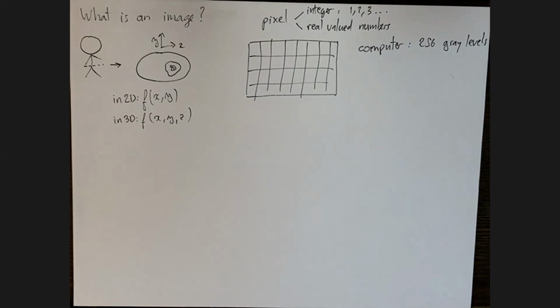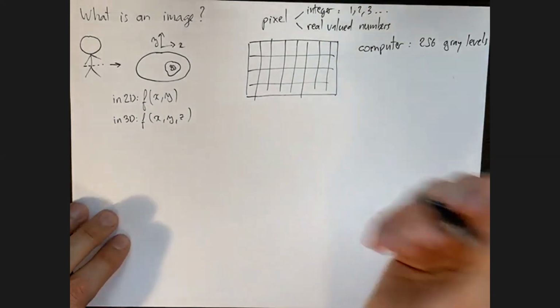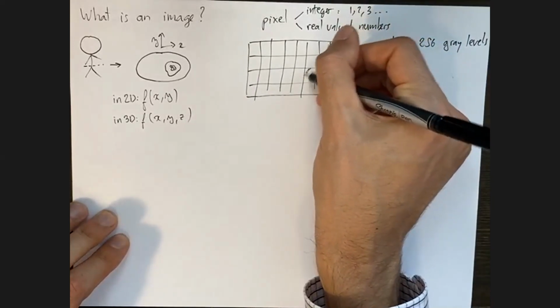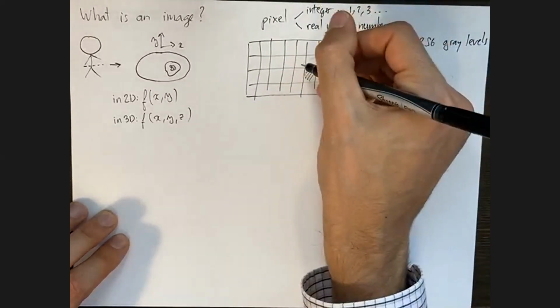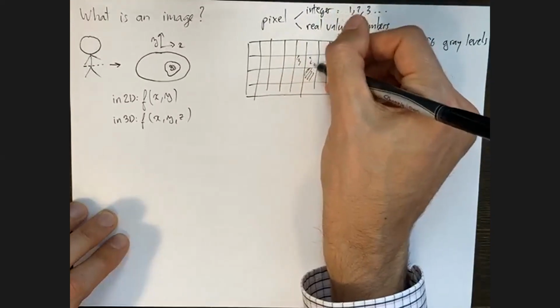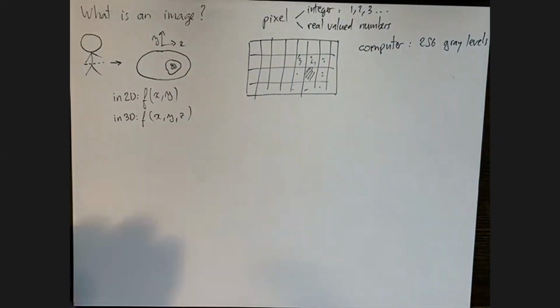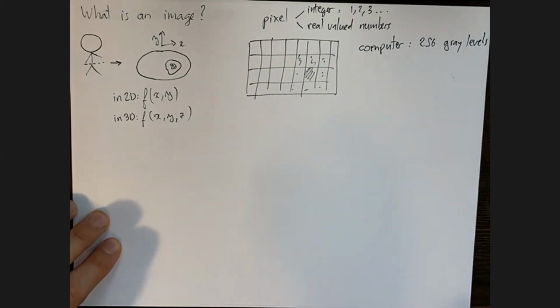We have the image that's represented as an array of numbers. And so, essentially the numbers are going to be higher wherever we have maybe a higher radioactivity, and then they're going to be lower in different regions, and that allows us to create a representation of the distribution that's computable by the computer.